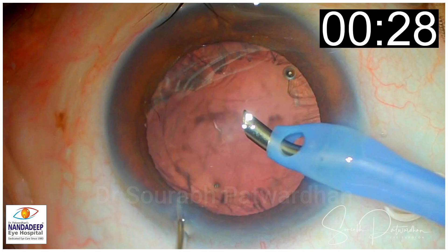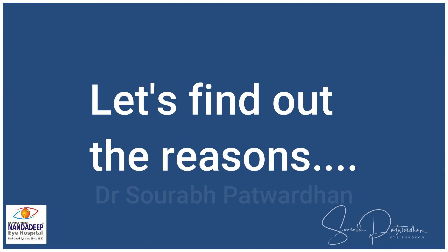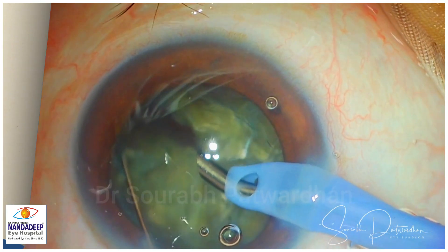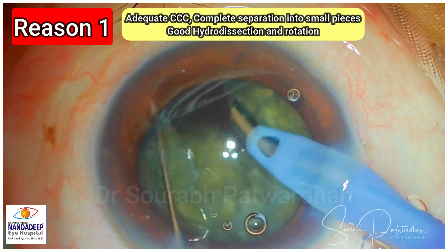So let's start from the beginning. Good preparation is very much important. You should have adequate size CCC, good hydrodissection and good nucleus rotation. And then you separate the pieces completely till the posterior plate as I am doing now.